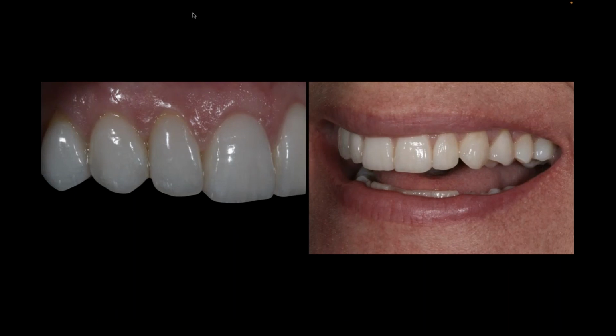And if we can create that very translucent looking effect and still get the color and value we want, I think that's where teeth look the most natural for us. This is a veneer case from a bunch of years ago, but I'm not usually happy with many of my cases, but I do like how natural these teeth look. And I think it's really just because of what I said, that translucency, that surface topography, and then supporting the value and the color and the chroma from the inside.